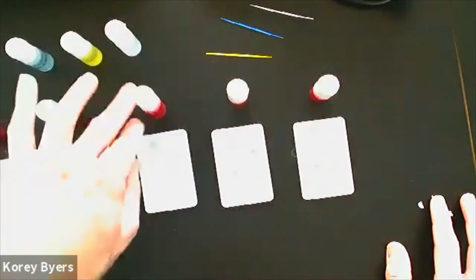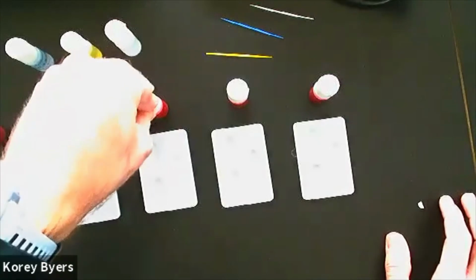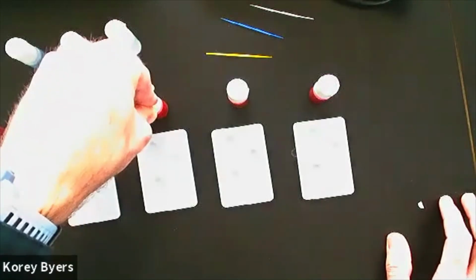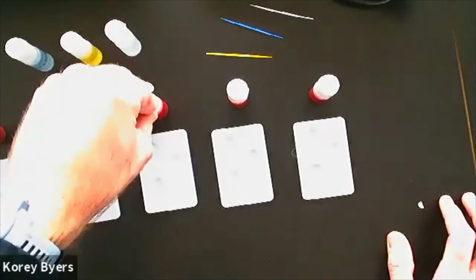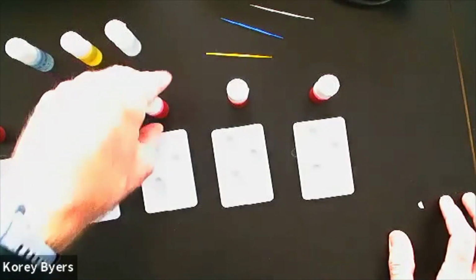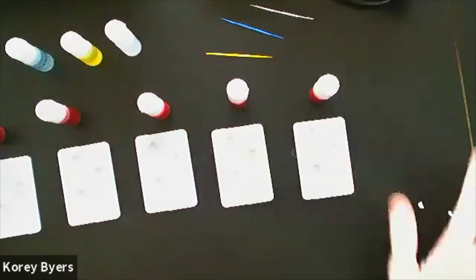Somebody asked last night why they don't have names. If you ever do work in one of these clinics, to reduce bias and reduce gossip and HIPAA violations, they often just label things sample, because if you're the technician, you have really no reason to know the names, you're just trying to figure out what the blood type is. So they label them sample 1, 2, 3.